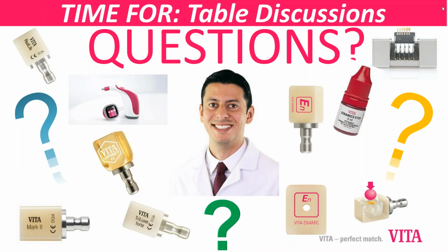Dr. Matthias Kern from Kiel University in Germany, the most northern university in Germany, has published data on bonding to zirconia with MDP for over 20 years. So it's something that doesn't have any discussion. Are there other things available? Yes, there are, but what we used based on this research, at least from my experience for the last 6 years, Dr. Blatz's probably 20 or more, is with MDP. All right. Research is important, so stick with what works and has been proven.